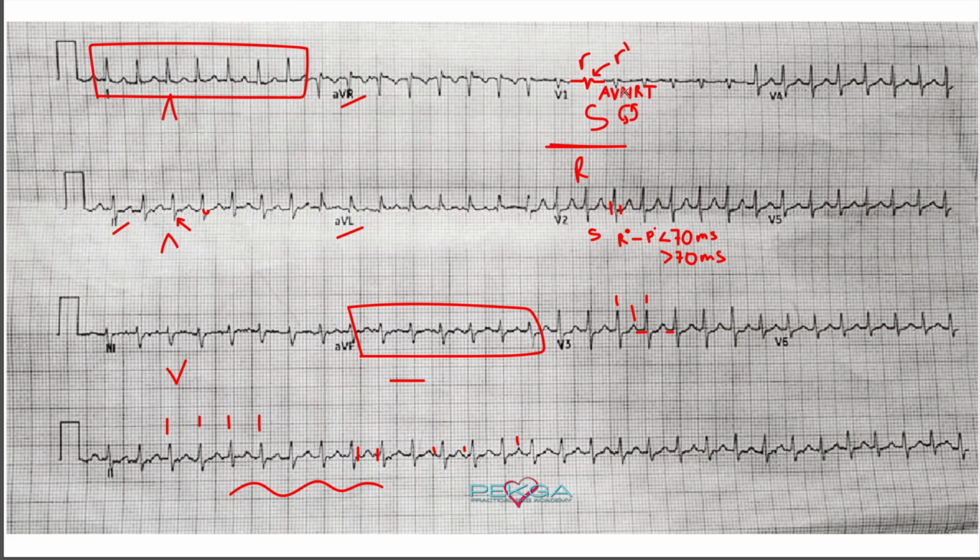Here we're just talking about ECG. What can you use to kind of quickly deduce or help you out? This is something that's very useful to physicians in a clinical setting, quick tips and tricks to help them pick which method of treatment they are going to be applying to this particular scenario.